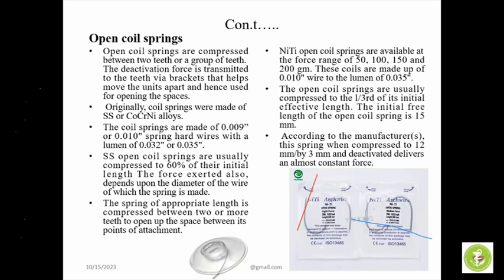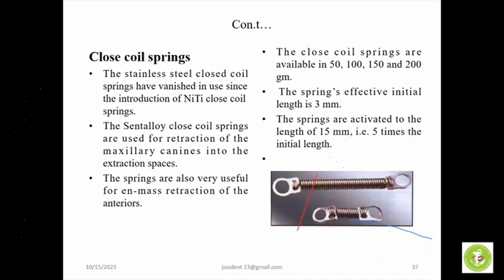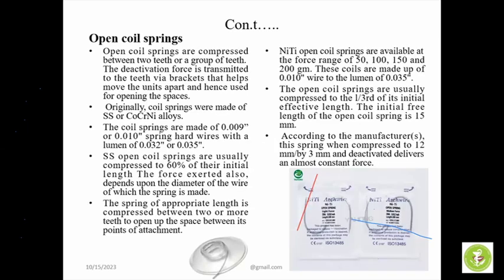In the first application, you need an additional length of 2 to 3 millimeters, which means in a space of 5 millimeters, you have to compress 8 millimeters length of open coil spring, so that those 2 to 3 millimeters of decompression will bring about space opening. You don't apply a very large coil spring, as it will bring some rotational change. Always it should be within the limit. Some authors recommended adding the width of the bracket to the distance between two brackets. That's quite enough to bring a gradual space opening with minimal or no rotational change.